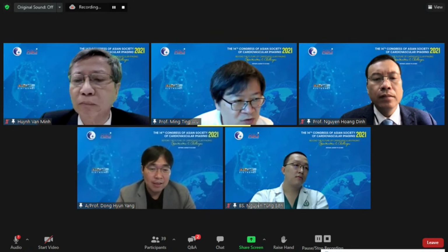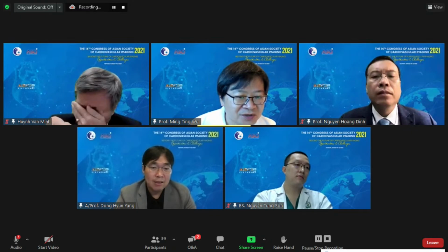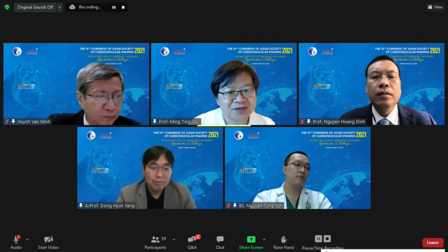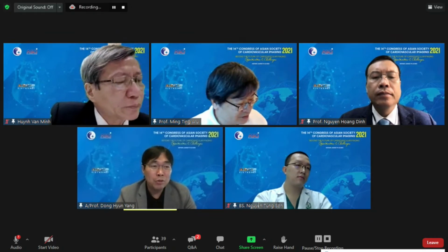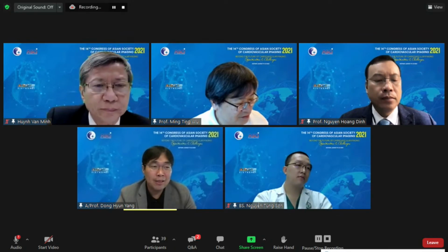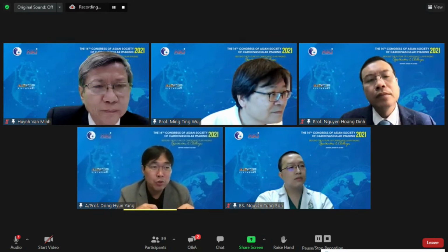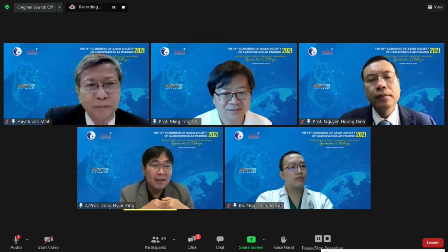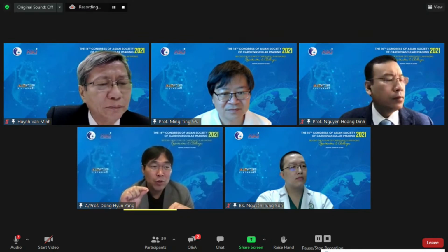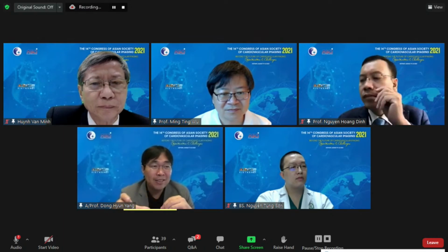So what's the minimal spatial resolution required, in your opinion, to get a good flow presentation? Yes, that is also a very important question. Spatial resolution is also highly related to the scan time. So if we want a small spatial resolution, such as 1 millimeter isovoxel, scan time will increase.